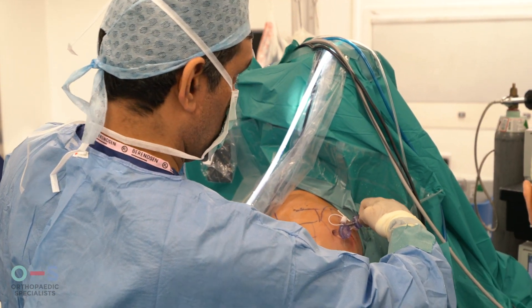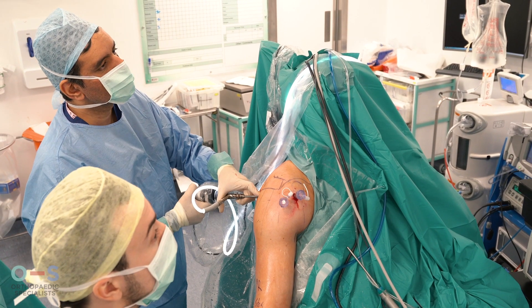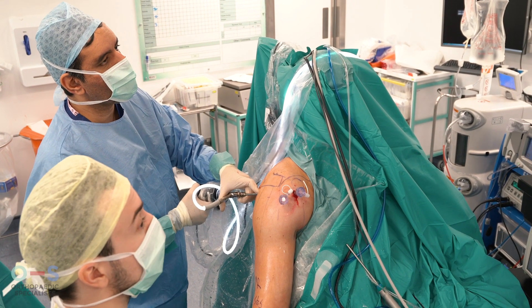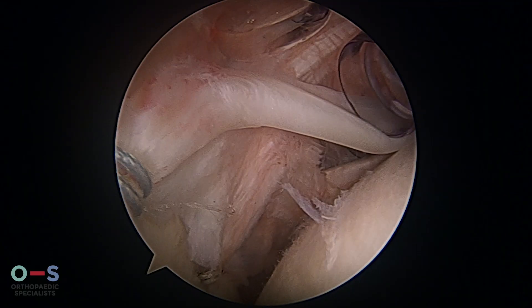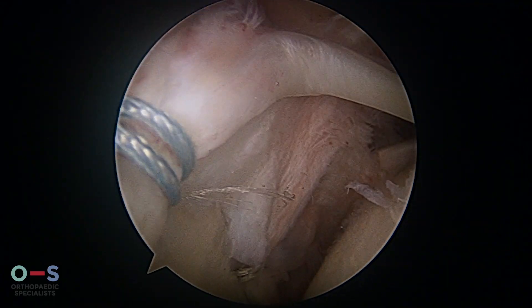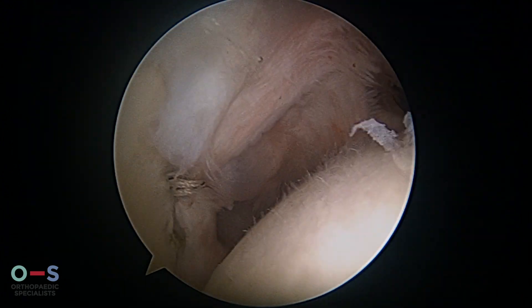Once the repair is complete, we have a look inside the shoulder and assess the repair. Here is the final product of the repaired ligaments.